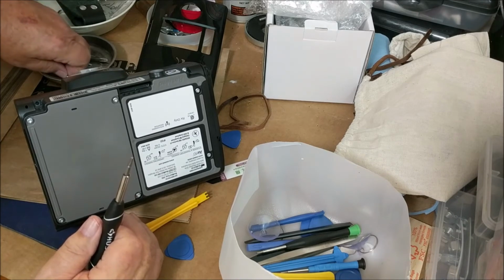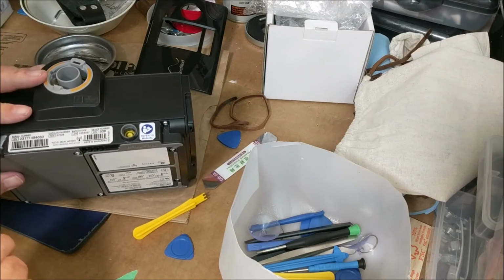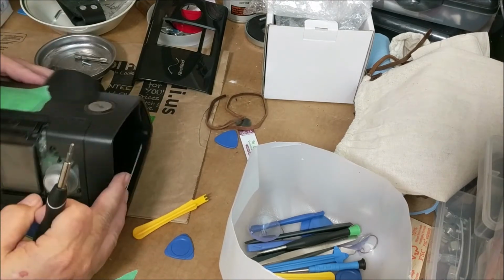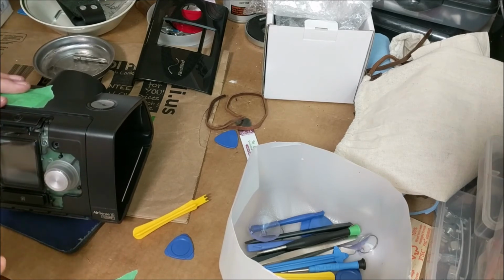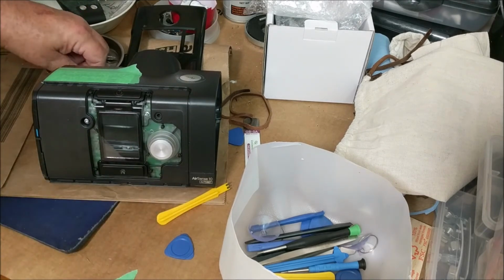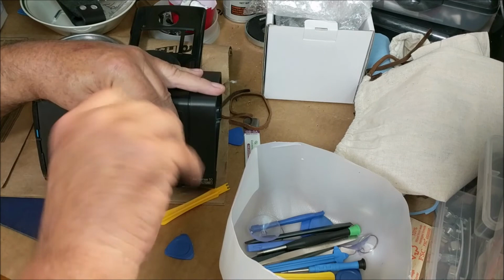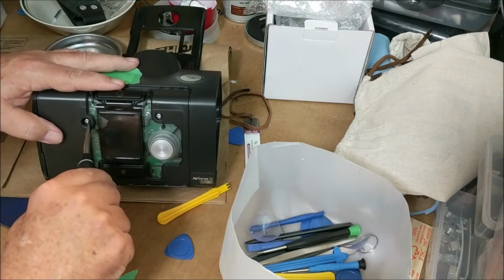My other one's still working fine, but I regretted not taking advantage of this. But I don't regret not looking after myself by allowing somebody else to control. You know, hackers can do anything. If they knew which was an airline pilot's machine, they could go in and tamper with his pressure and make him sleepy, or a race car driver, or anything. I mean, it goes on and on. We know how to take care of ourselves. But if your machine's not working, it can creep up on you.